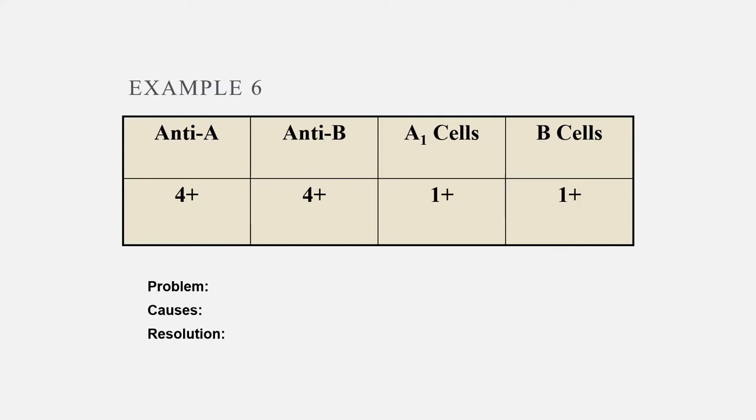what you can do is take a donor unit that is labeled A1 and a donor unit that is labeled B, and phenotype those donors for M. If you have done an antibody workup and determined it is an anti-M causing this discrepancy, phenotype some donors, find a B donor that's M negative and an A donor that's M negative. And you're basically treating those donor cells as your reagent cells. So you can prove that this AB patient does not have A1 antibody or B antibody.